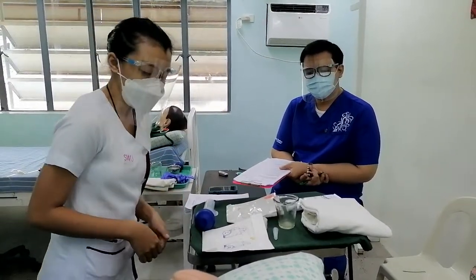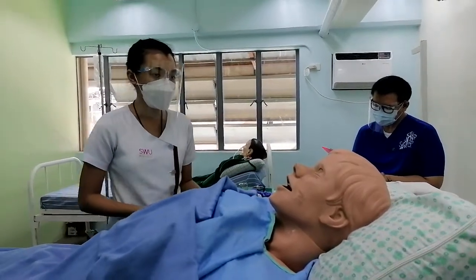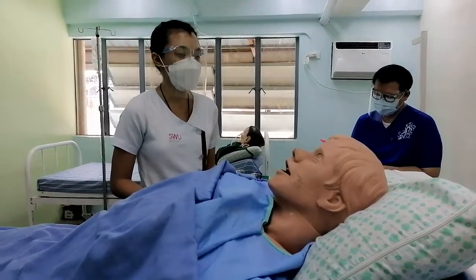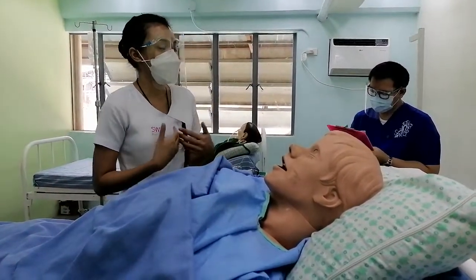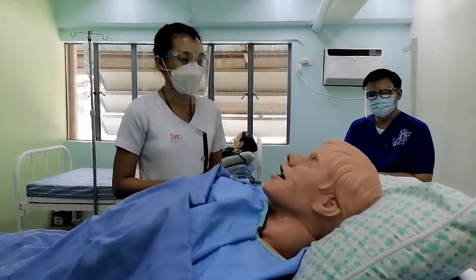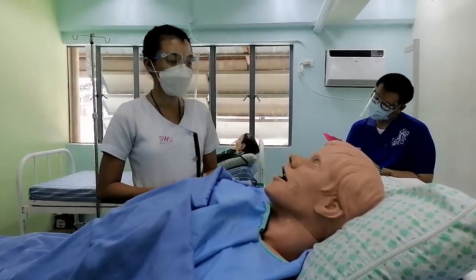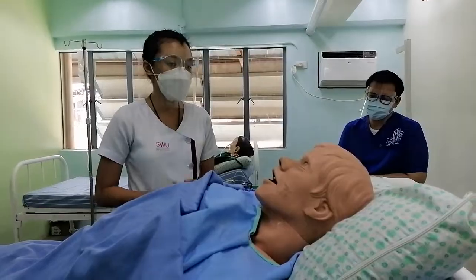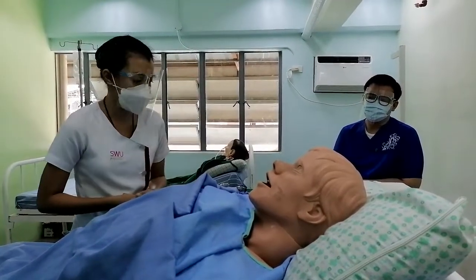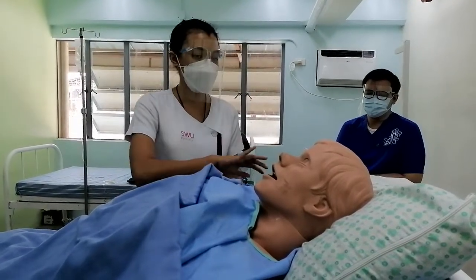After that, I will elevate the patient's position to a high Fowler's position, probably 90 degrees. Due to gravity, this will facilitate the tube going down and also prevent aspiration. But if the patient is comatose, we will position the patient in a semi-Fowler's position with the head supported by a pillow. So, sir, I will elevate your bed to a 90 degree position.